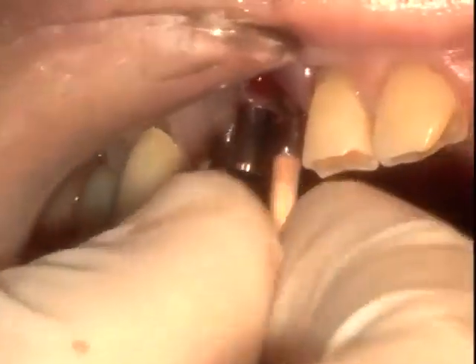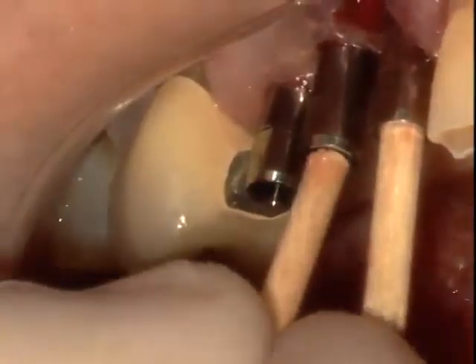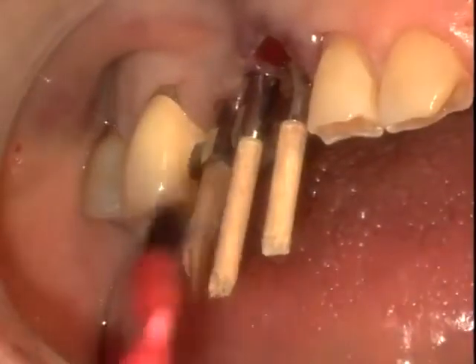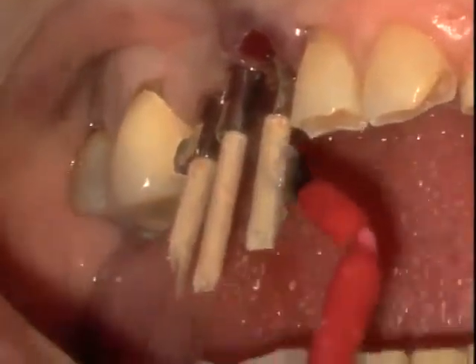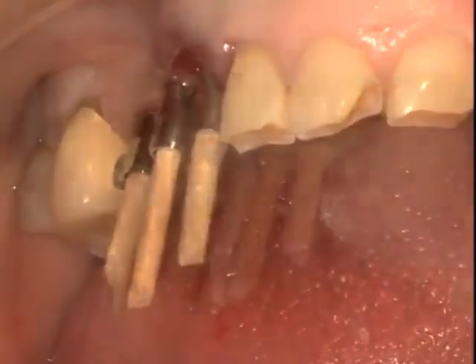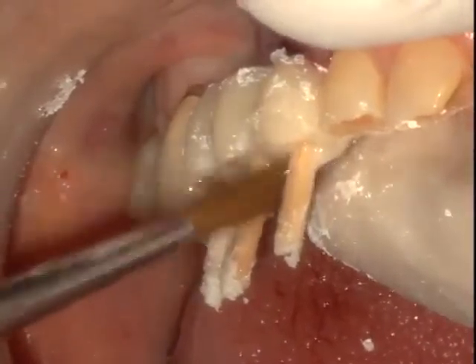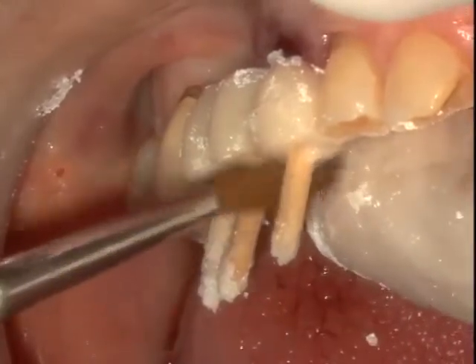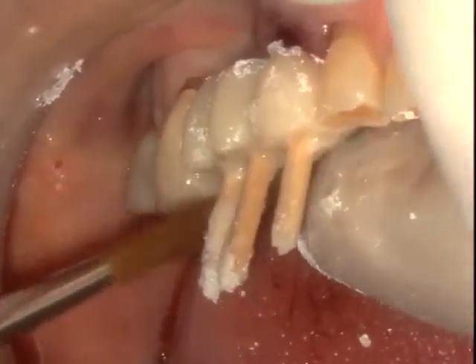One is to remove the carriers and to place individual abutments that are pre-selected. But in this case, in order to facilitate a screw access channel, we simply utilized the carrier assemblies from the Ankylos system. And what you're seeing here is just the back ends of the applicators, wooden sticks that can fit perfectly into these spaces that will accommodate the access to the screw channels when we reline the temporary restoration. We reline this, and those sticks really form a basis for us to gain access to the screw channel.